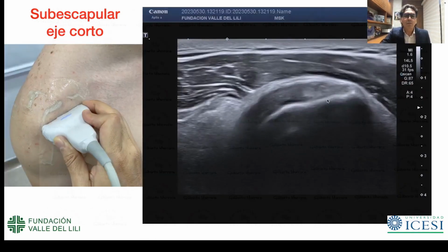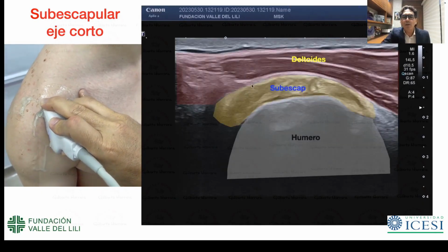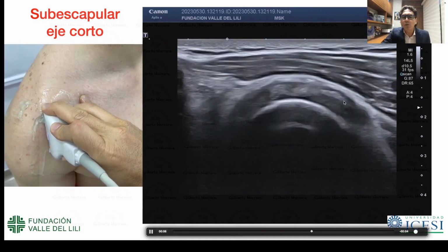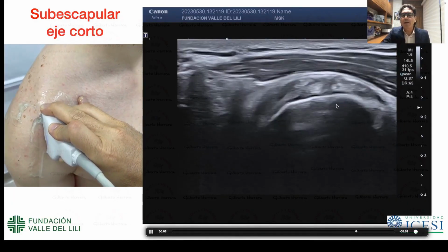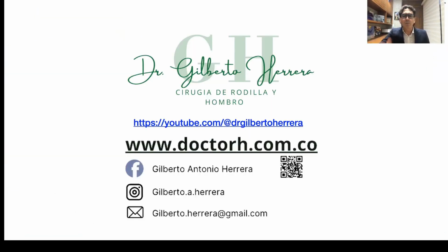Let's take a look. So here we've rotated to see the short axis of the subscapularis, and to look for a footprint that always shows both axes. It's very flat, more so in the long axis than the short, and the subtendons range from 3 or 4 up to 6 subtendons. And we'll see how to determine whether that's pathological or not. These are the anatomical features of the shoulder, the subscapularis in the long axis and short axis from position 1.